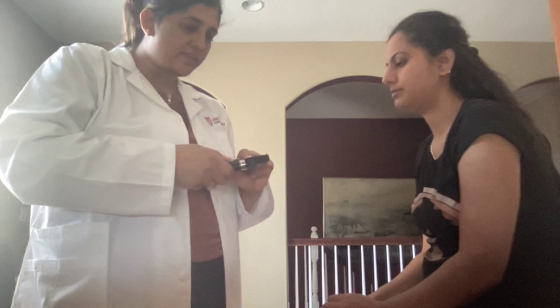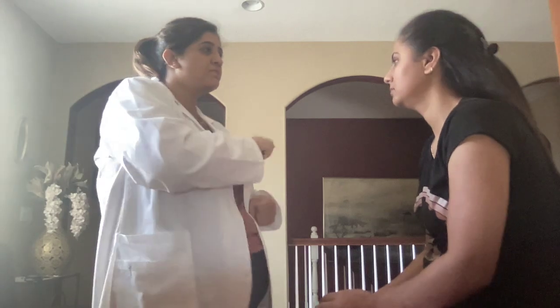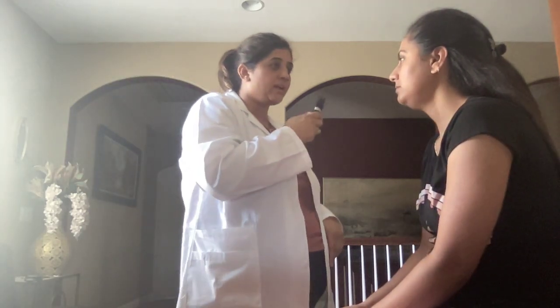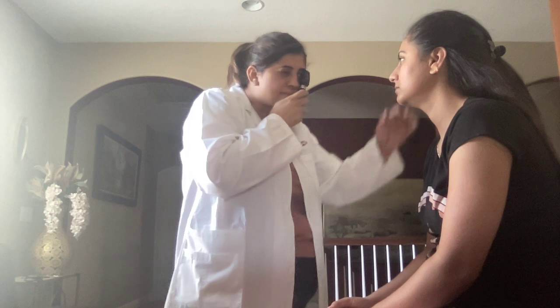The diopter is at 0. I see the circular. Okay, so I'm going to be using the right eye. The lights are dim. Right eye with the right hand. I see the red reflex, holding your hand.